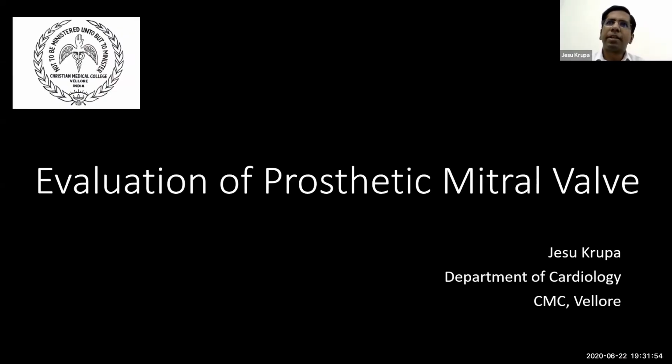Good evening, everyone. So we'll start with echo evaluation of prosthetic mitral valves. Again, this is part of the basic series. So the focus is not going to be people who are very well versed with doing echo or even assessing prosthetic valves.